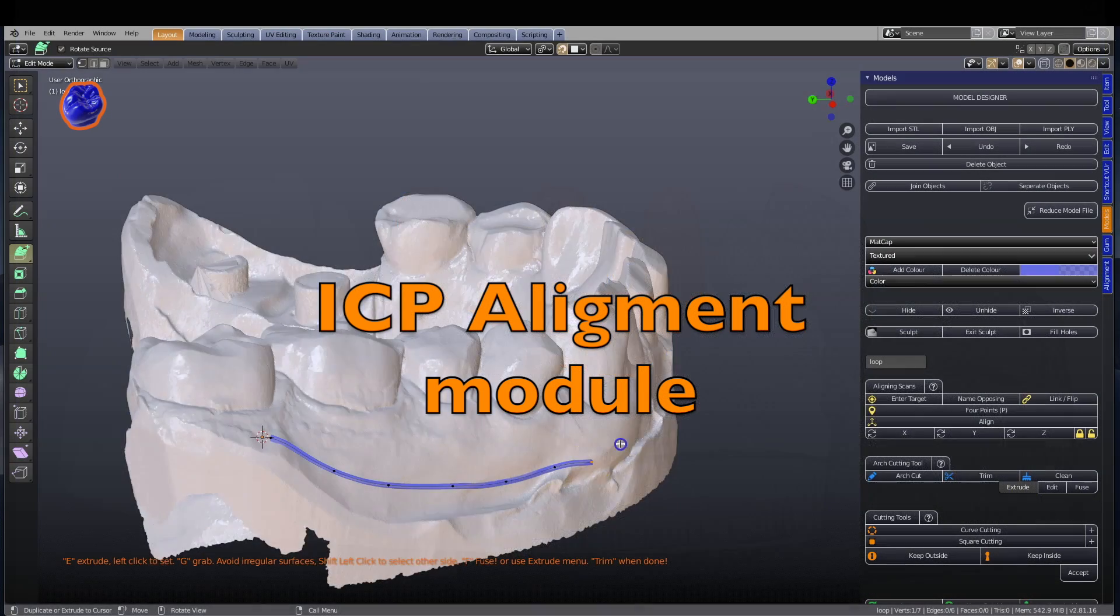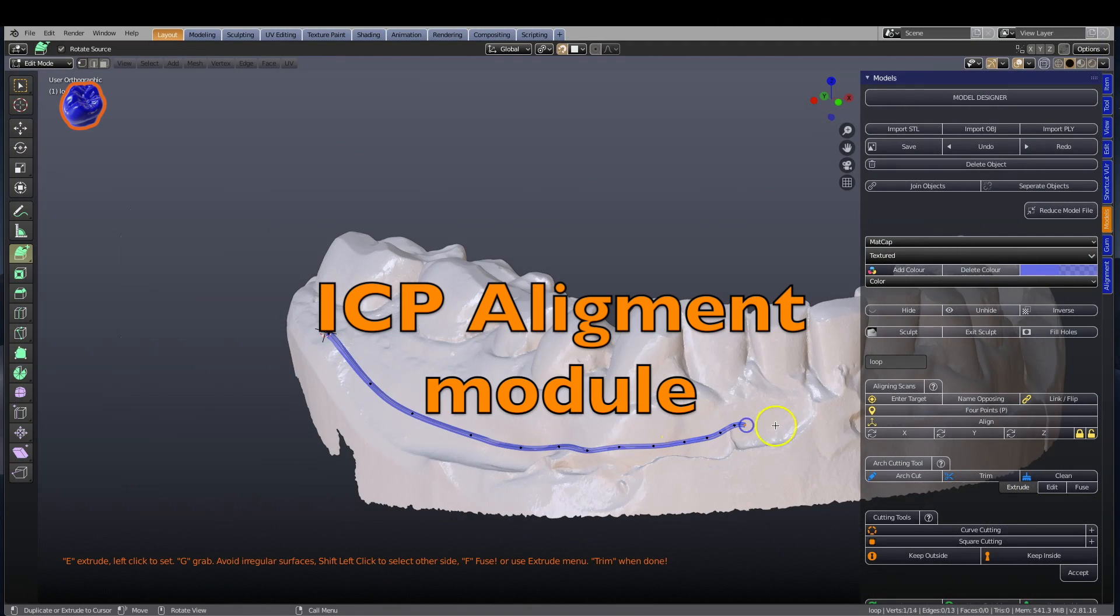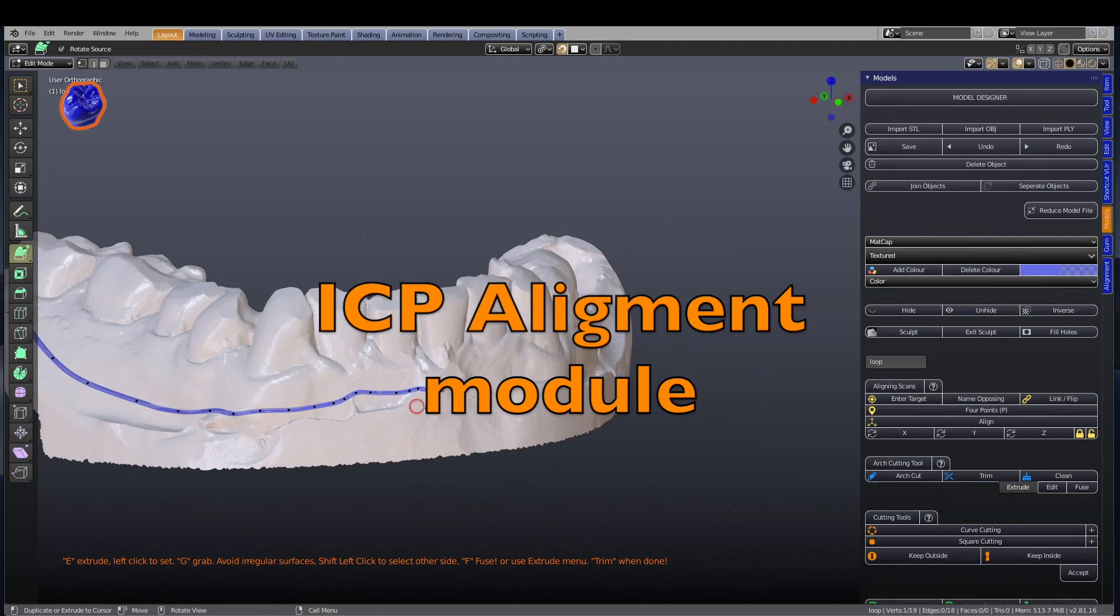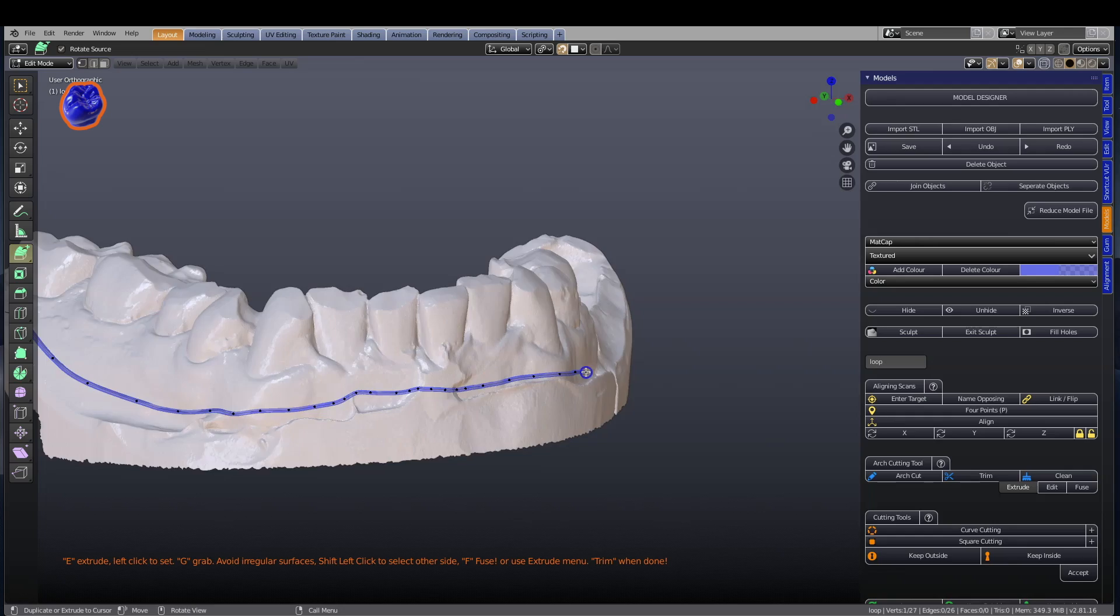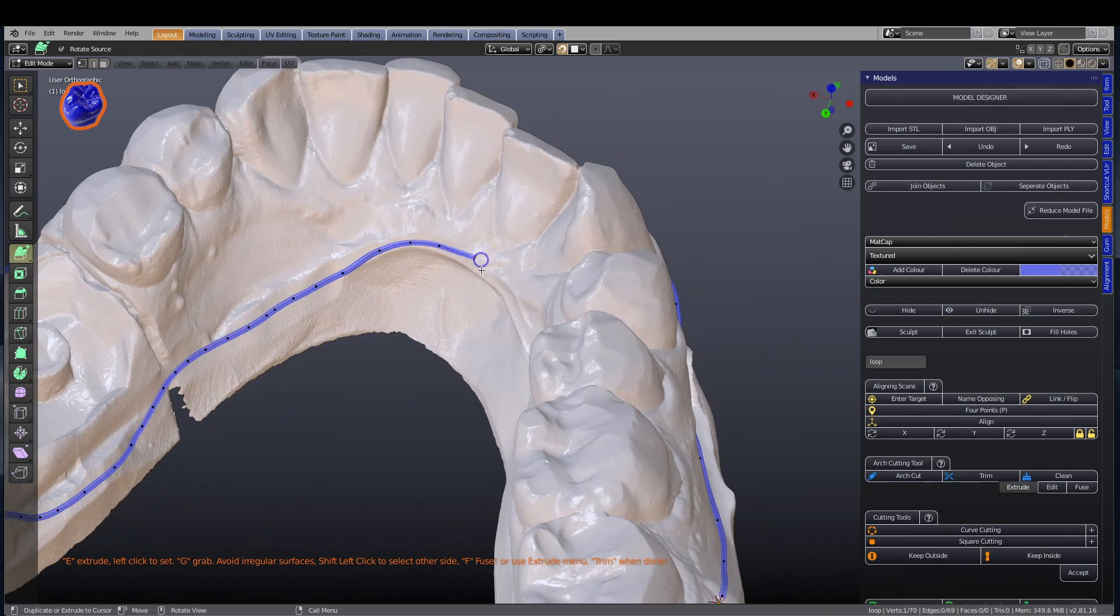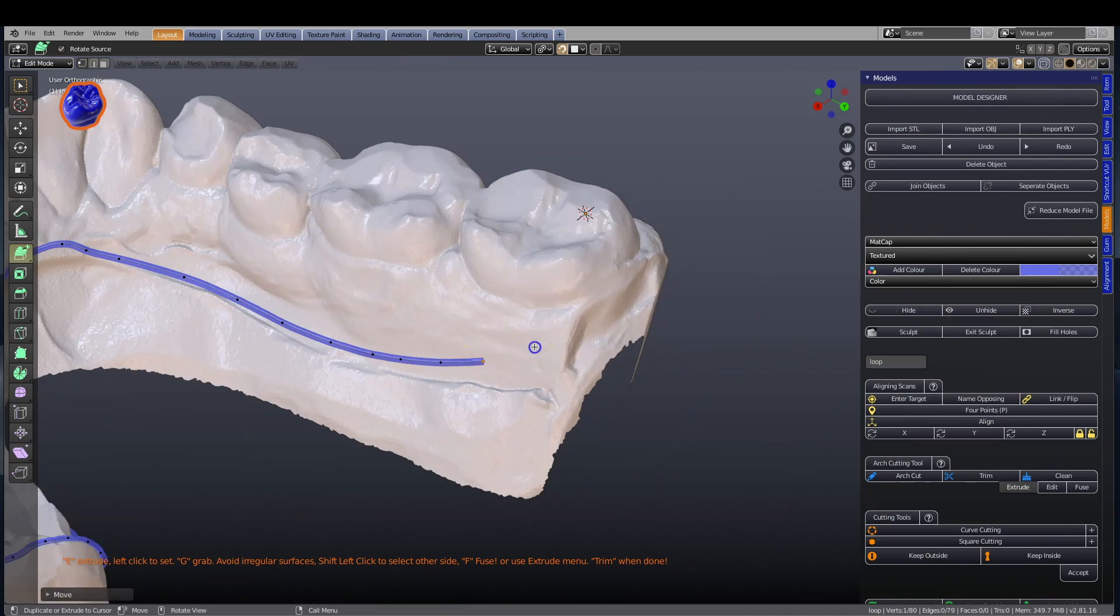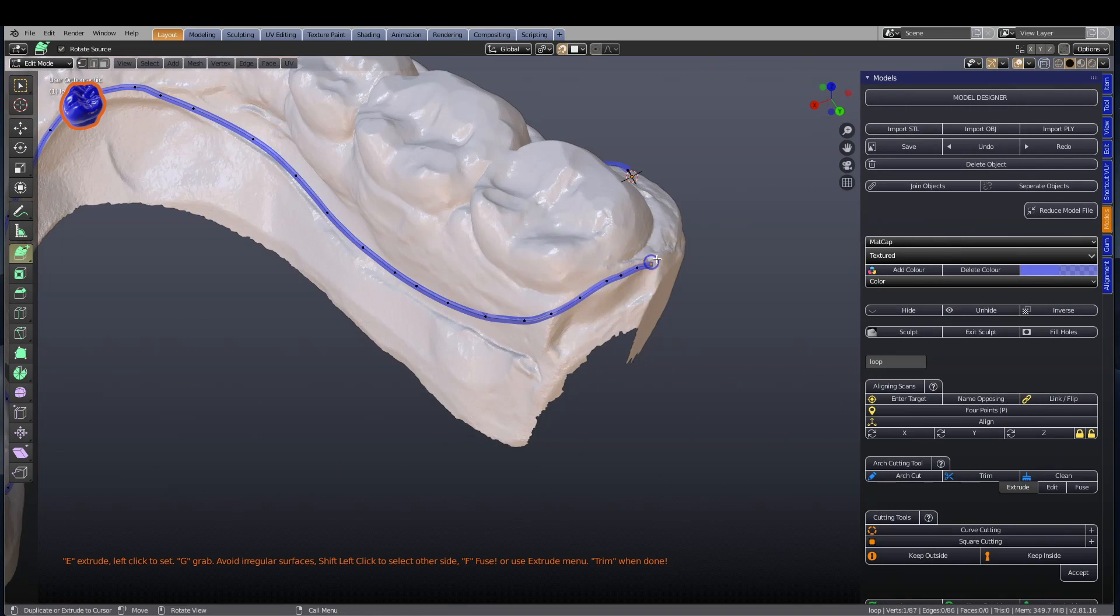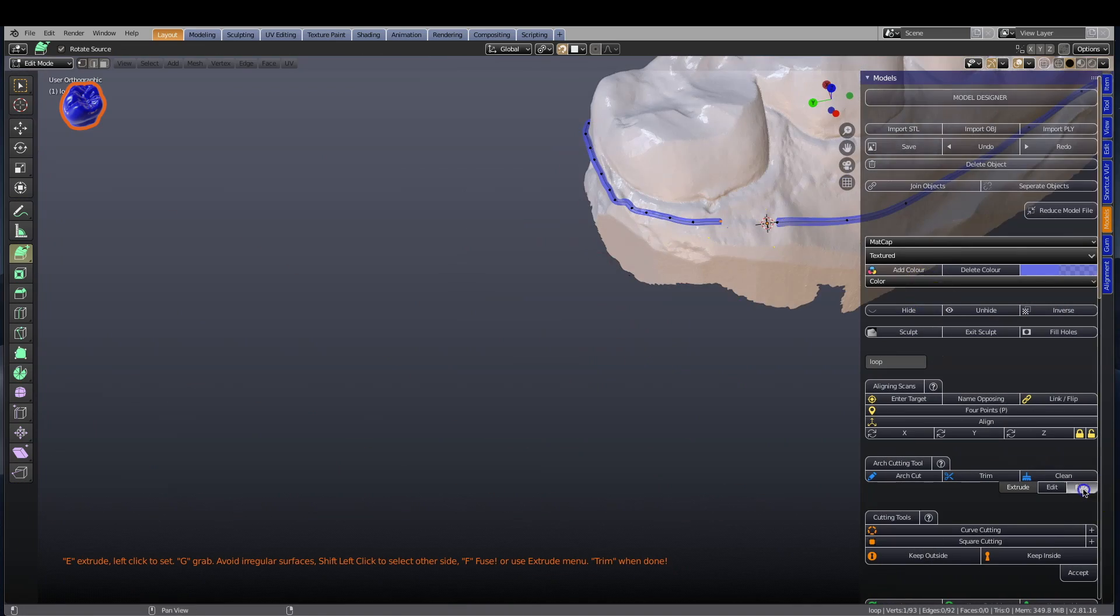Blender for Dental is powered by the open-source Blender software program, with add-ons designed to take your digital dental experience to a whole new level.